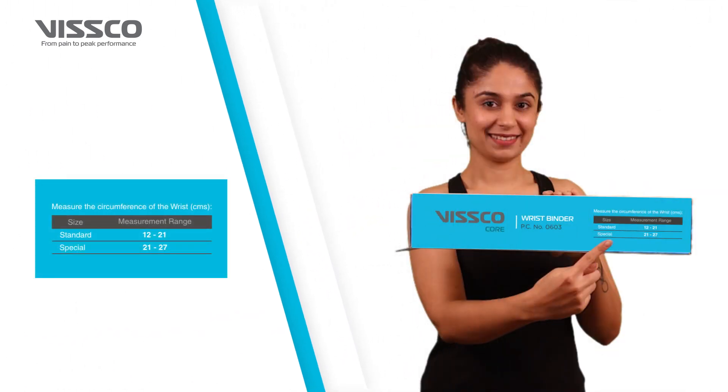The Wrist Binder comes in two sizes. You can select the appropriate size from Standard and Special.